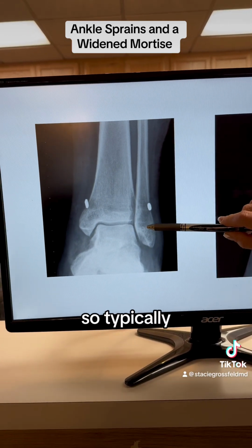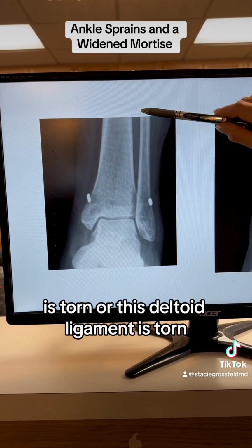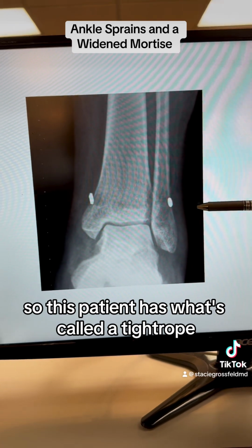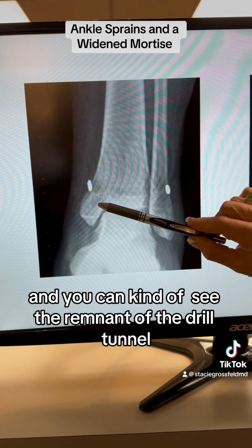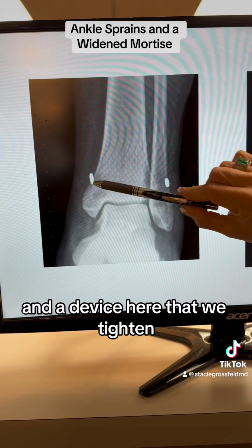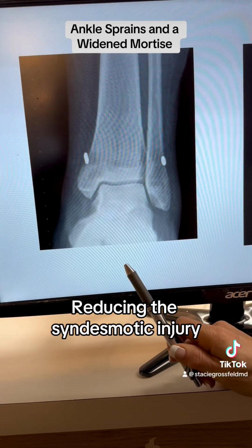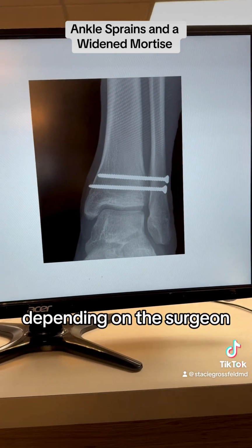So typically with a syndesmotic injury, this ligament called your interosseous ligament, which you cannot see, is torn, or this deltoid ligament is torn. So this patient has what's called a tightrope, which is where we drill a hole through this bone, and you can kind of see the remnant of the drill tunnel. And we have a device here and a device here that we tighten, which pulls these two bones together, reducing that syndesmotic injury. Another way to fix it is with 2 screws or 1 screw, depending on the surgeon.